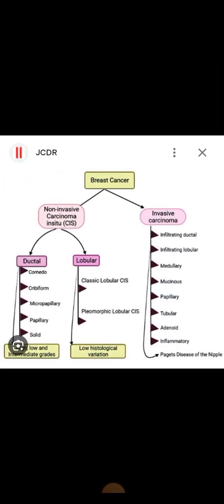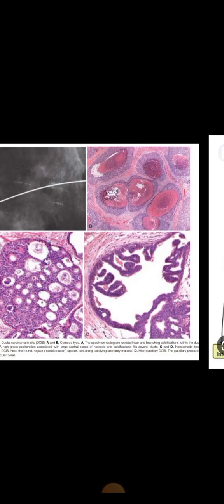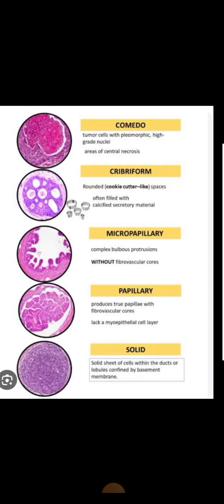Ductal carcinoma in situ, by definition, whether it is lobular carcinoma or ductal carcinoma, you can say that this type of carcinoma, which is carcinoma in situ, is confined and doesn't invade the basement membrane. It is confined only to the basement membrane.